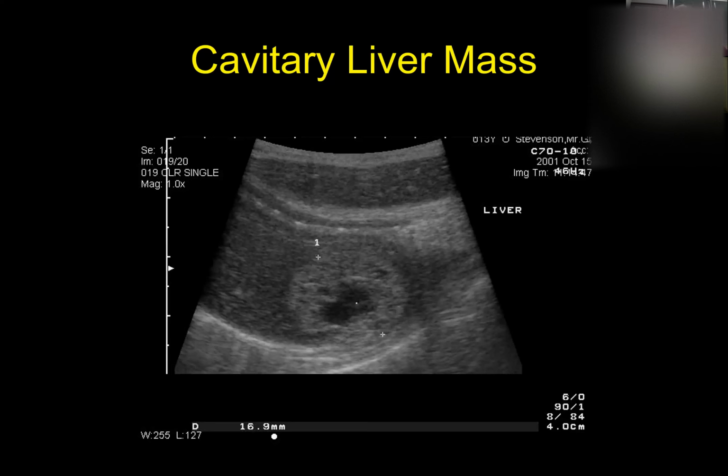And that will help them decide also. So it's kind of nice to know, and at least get in your mind if you think it's going to be malignant or you think it's more likely to be benign, because you can help advise the owner on what's the best next step to do.